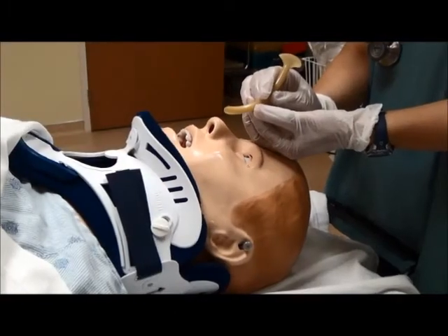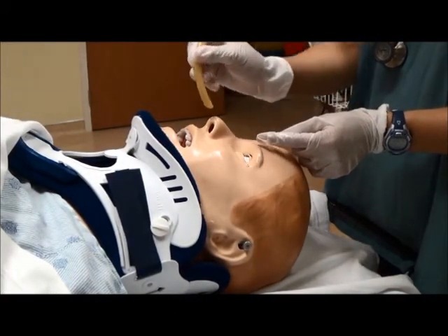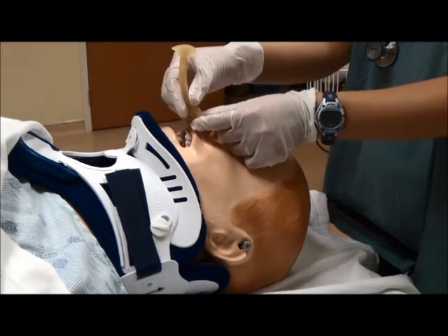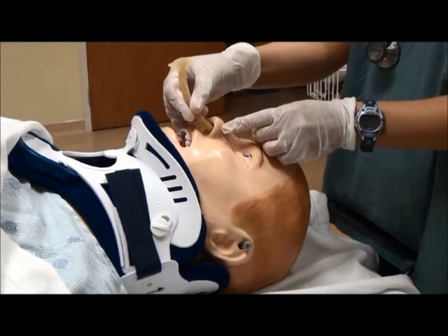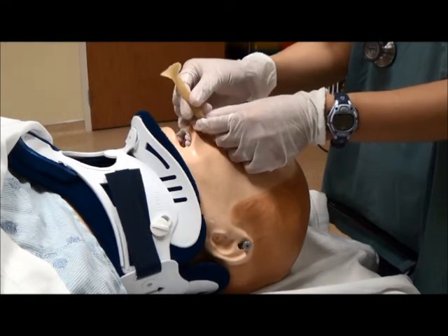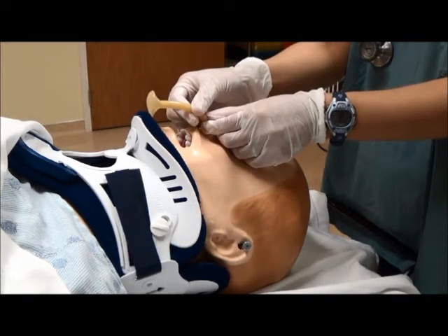To insert in the left naris, point the bevel towards the septum. Insert the first half, then rotate the nasopharyngeal airway 180 degrees and insert the second half.